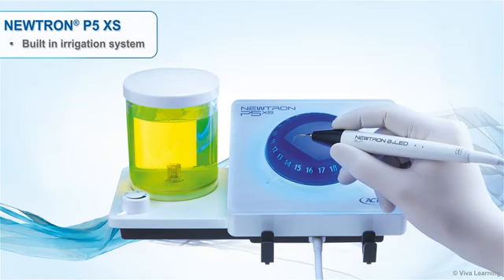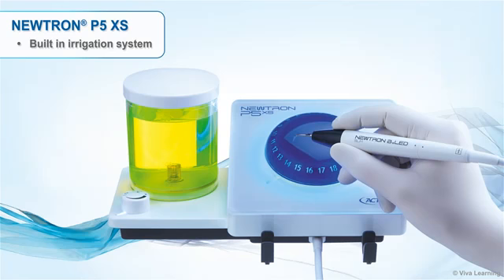For dentists who prefer to have irrigation built into the system, the P5XS offers the ideal solution.